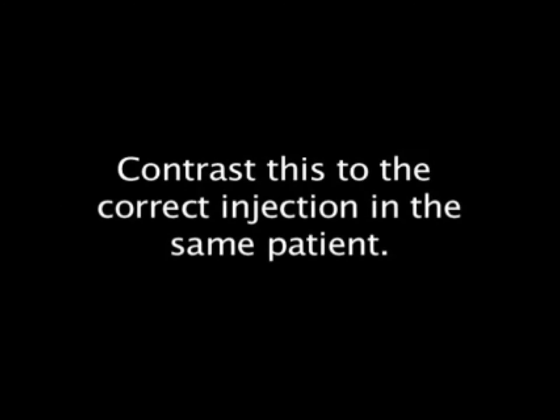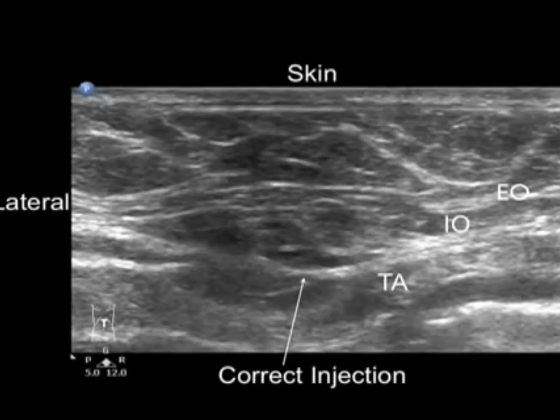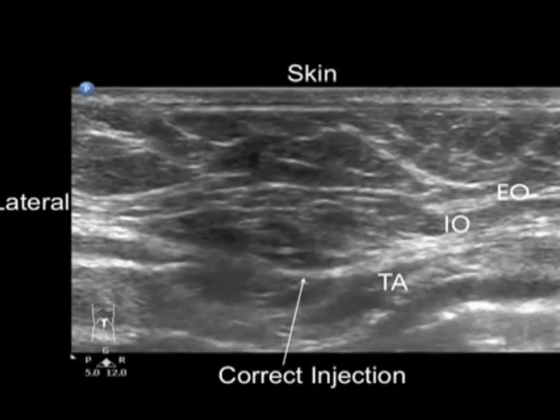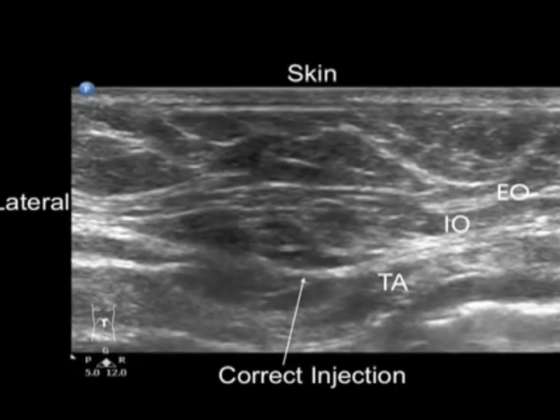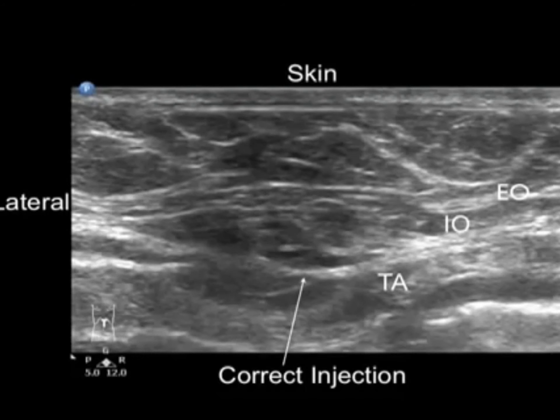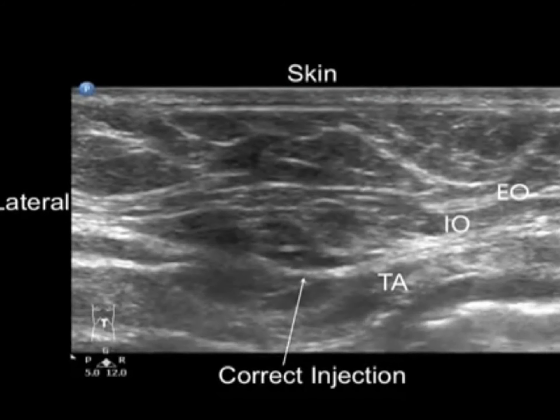Now contrast this with the correct spread of local anesthetic in the same patient. We will repeat the injection four times: one, two, three, four.